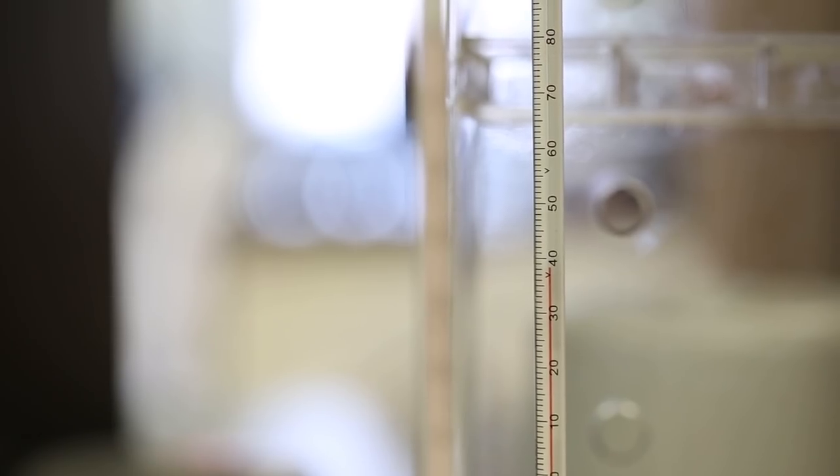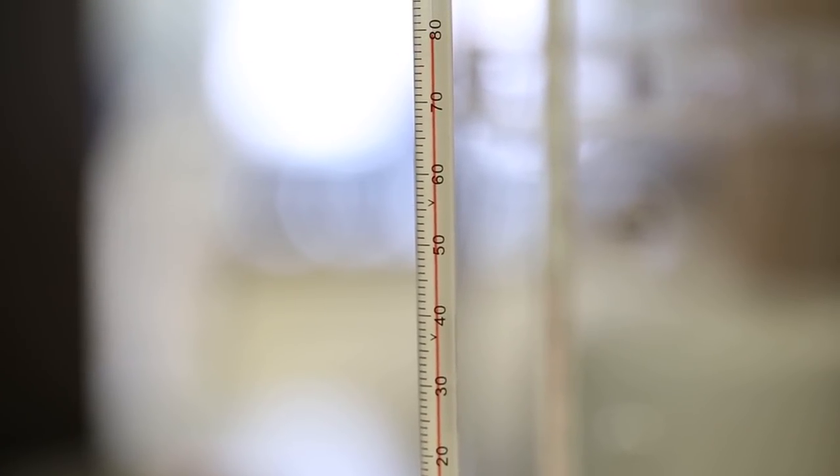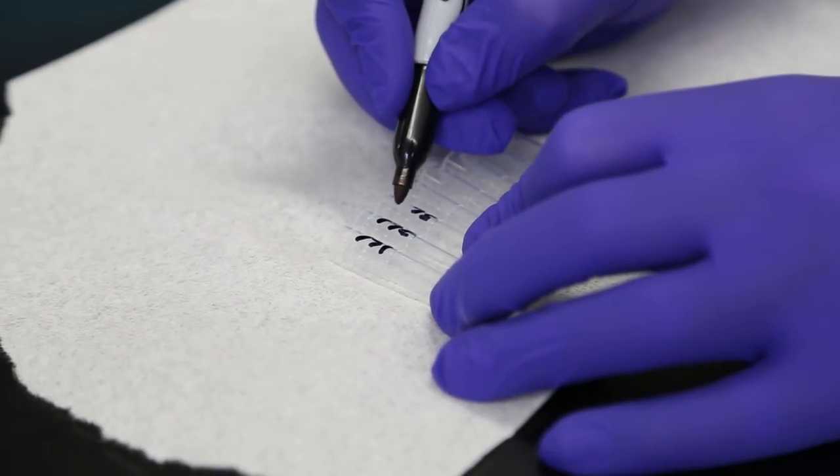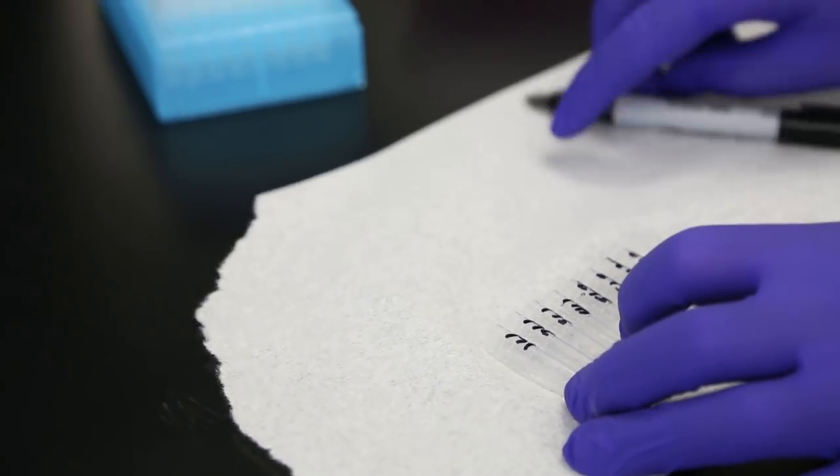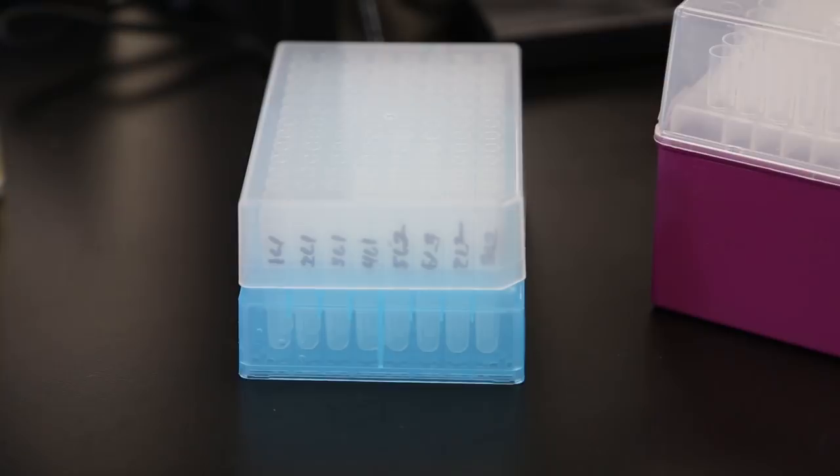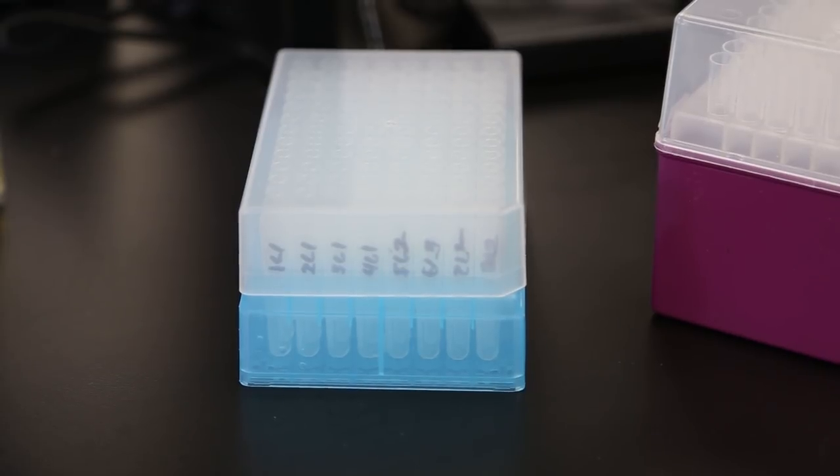Next, verify that the temperature on the first two heater blocks is 37 degrees and 80 degrees Celsius respectively. Take a strip of the 1.2 milliliter cluster tubes and mark them to correspond to your labeled samples. Return the cluster tubes to the rack and label any additional tubes as needed.